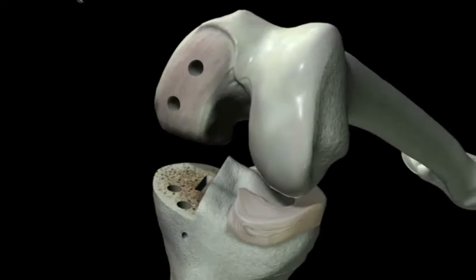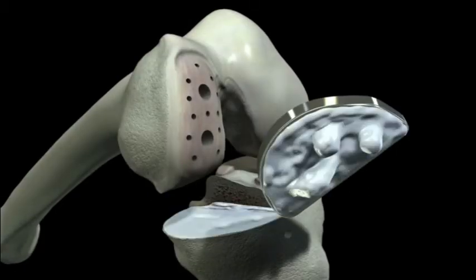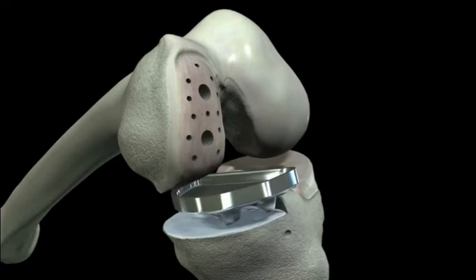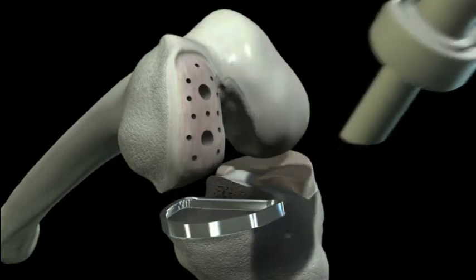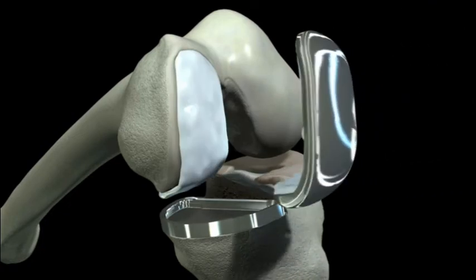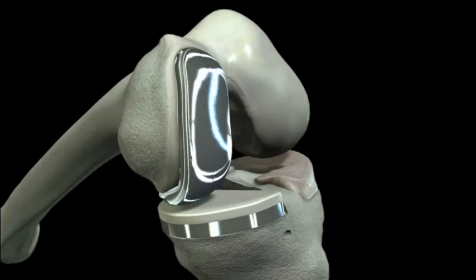Step 6: Cementing of implants. Drill 8 to 10 1.5 to 2mm cement holes to enhance cement interdigitation on femoral cortical surface. Apply a layer of cement to the surface of the bone, taking care to fill the holes created for interdigitation. Cement in the metal implants, starting with the tibial tray, and remove all extruded cement. Snap the poly into place by pushing down on the anterior edge.